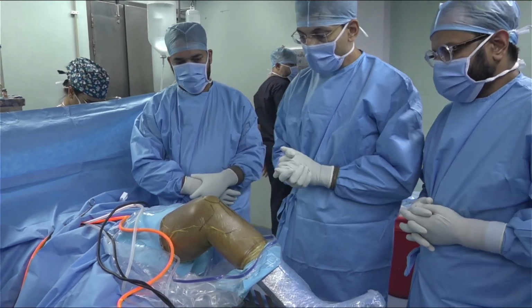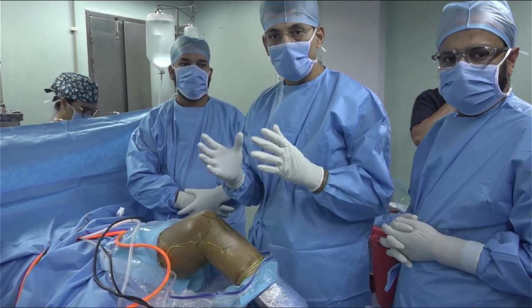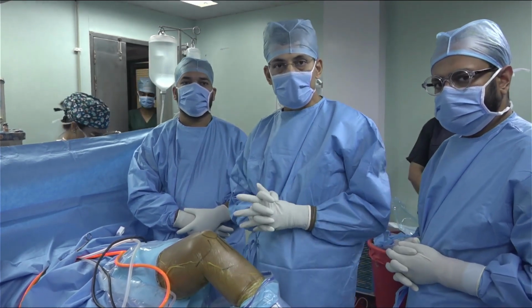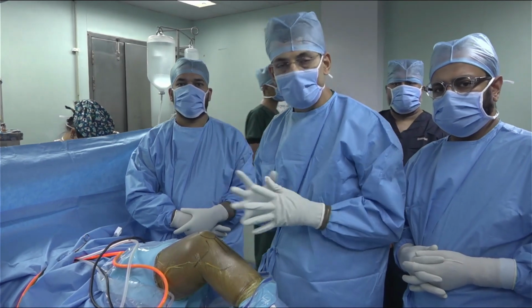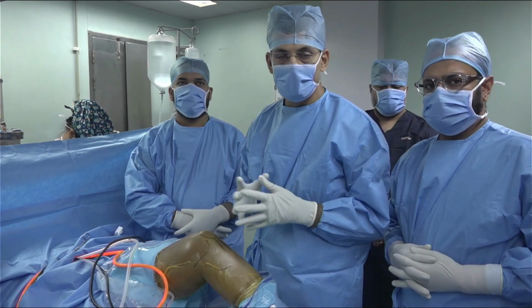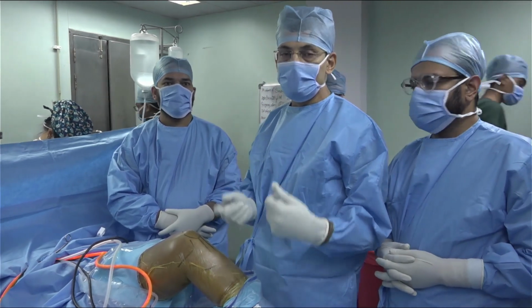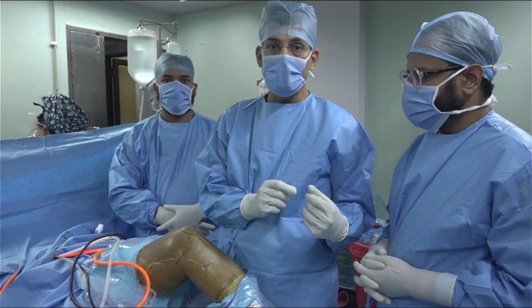So today we are using the Osteocare system, and the system will consist of an all-inside equivalent sort of ACL reconstruction with button fixation on both sides. Whenever we are doing an all-inside equivalent fixation, we always augment it with the use of a fiber tape. This button, which is an EndoButton Flex button, comes with an integrated fiber tape. The fiber tape is integrated into the button, and that can be tightened on a separate slot which is given in the PEEK button on the tibia.